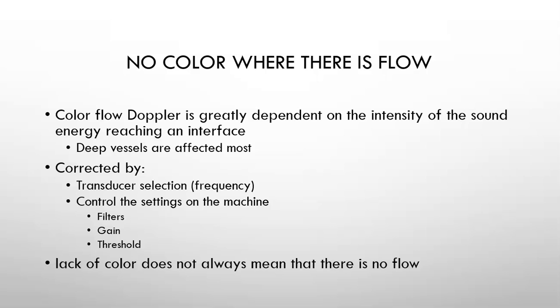A lack of color does not always mean there is no flow. So if you don't see color, that doesn't mean there is no flow. It's not a diagnostic criteria.